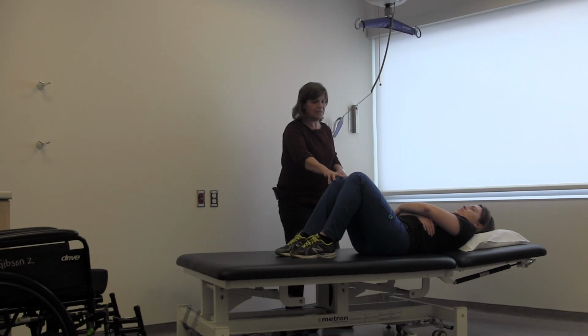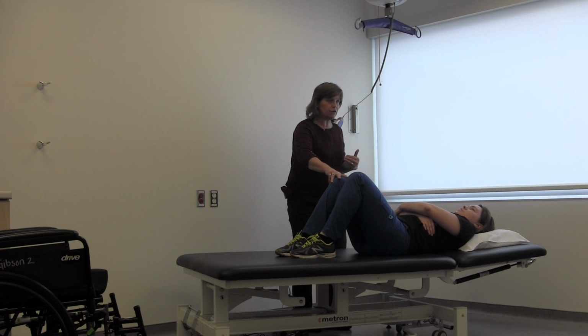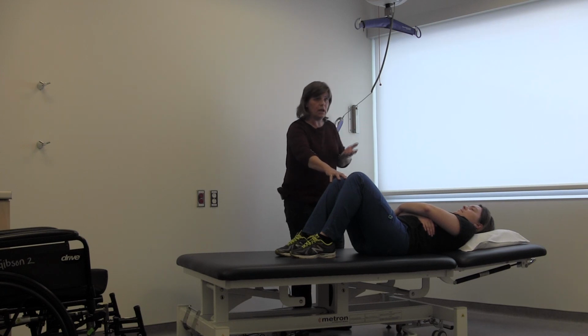Now, we're in this environment, but certainly in a patient's bed, you might want to put a towel or something down, right, for infection control. The next thing is we want to shift her to the right a little bit. If she's someone who just has a moderate deficit, she might be able to lift her hips, and I can just help, and that's how I want to show it today.